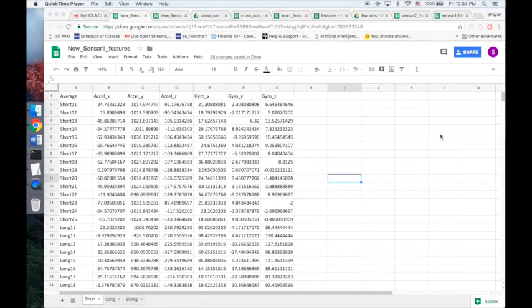In order to find features, we had to review the motion data outputs manually, and that meant observing them and trying to find patterns. Now, in part of our process, we performed different algorithms on the motion data output files, and one of them was to find the mean of each column for each trial. So here are the collected means for each trial of files, and that corresponds to the short stride files 1 through 15. This is the mean corresponding to each column: acceleration x, y, z, gyrometer X, Y, and Z.